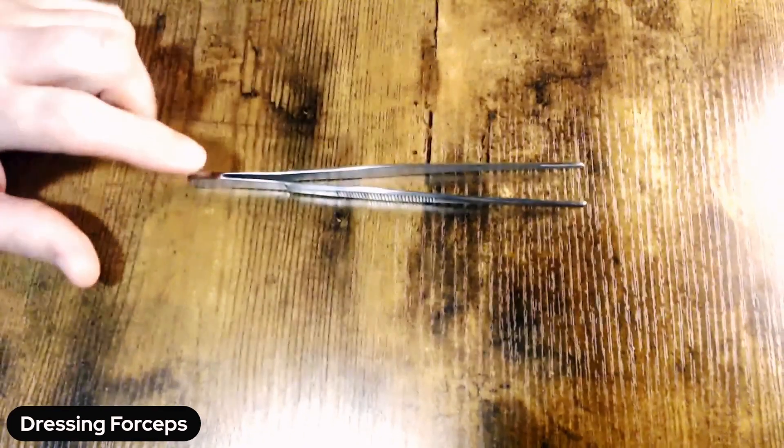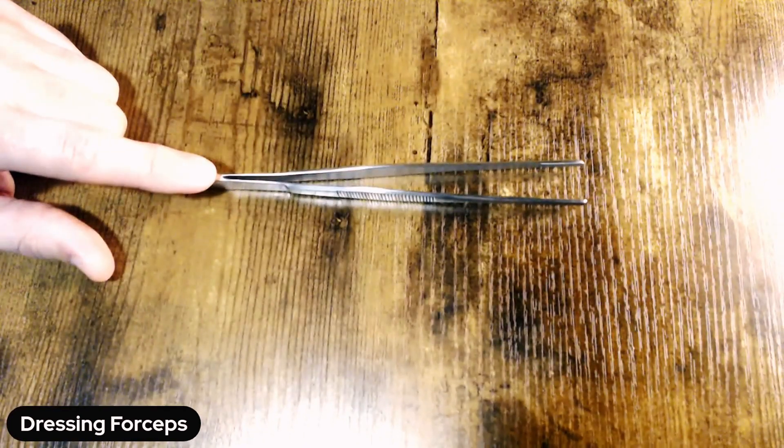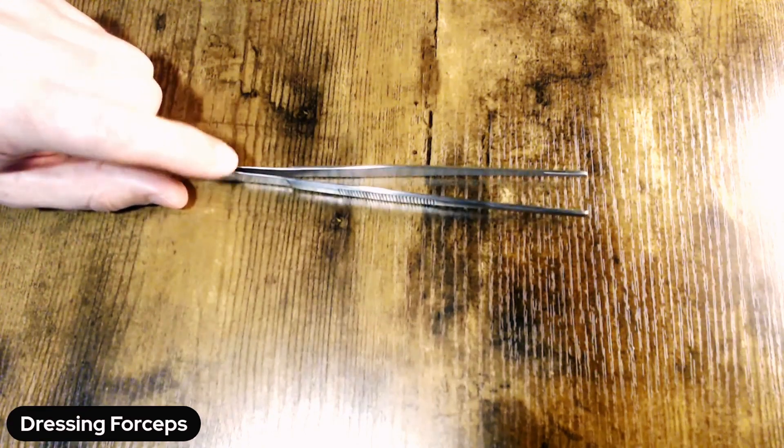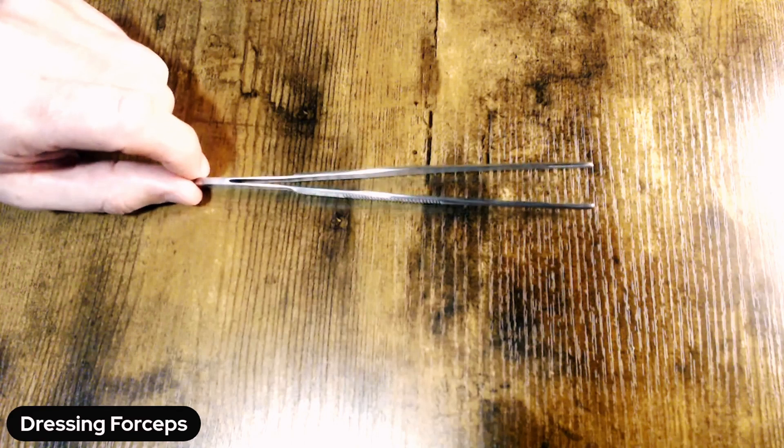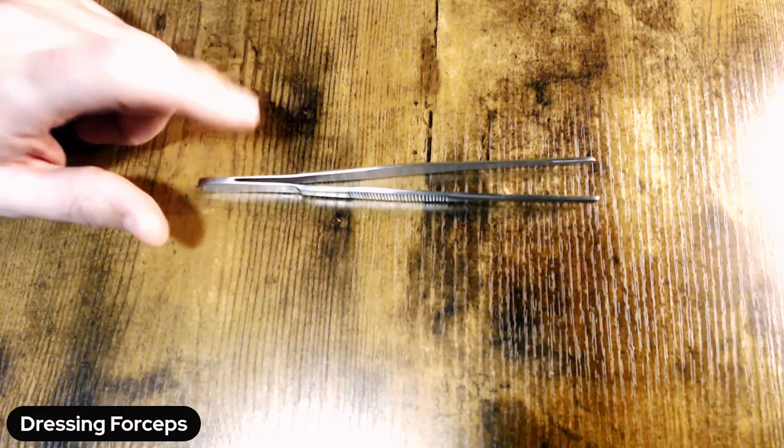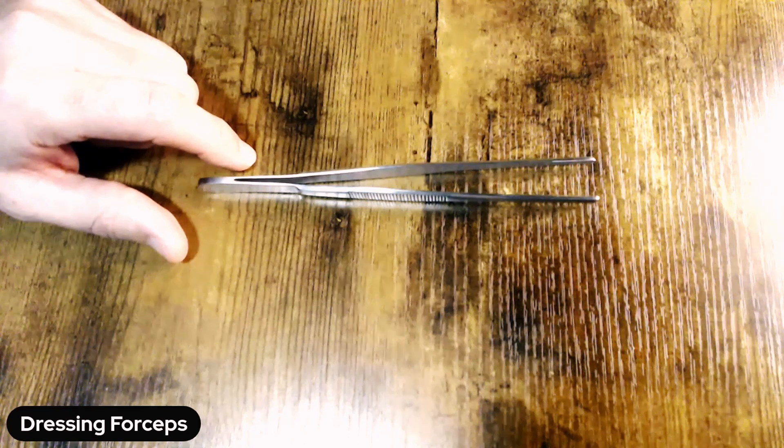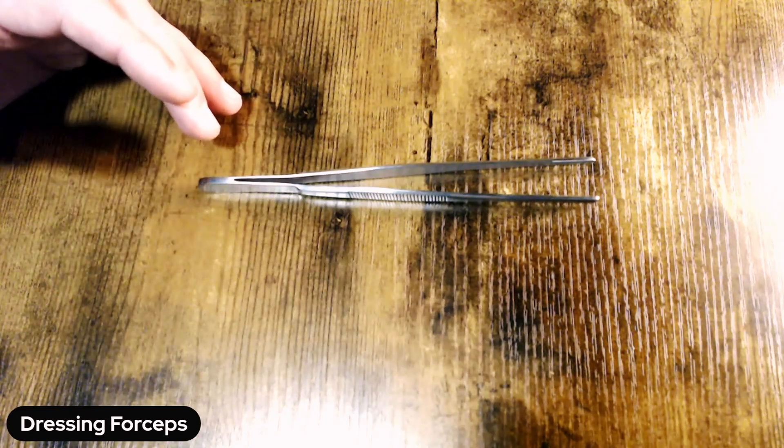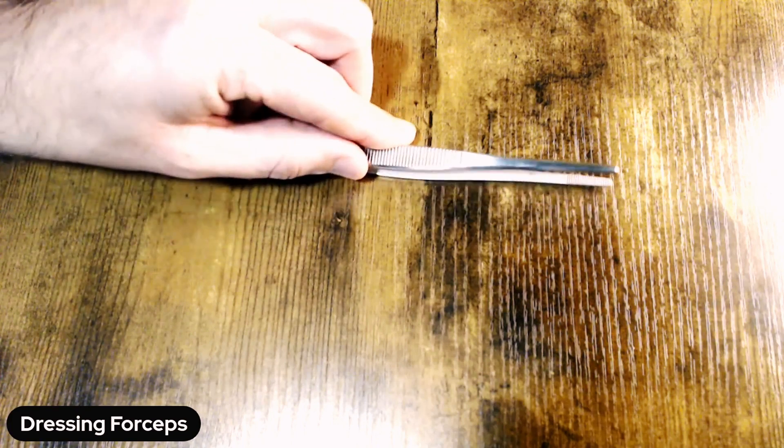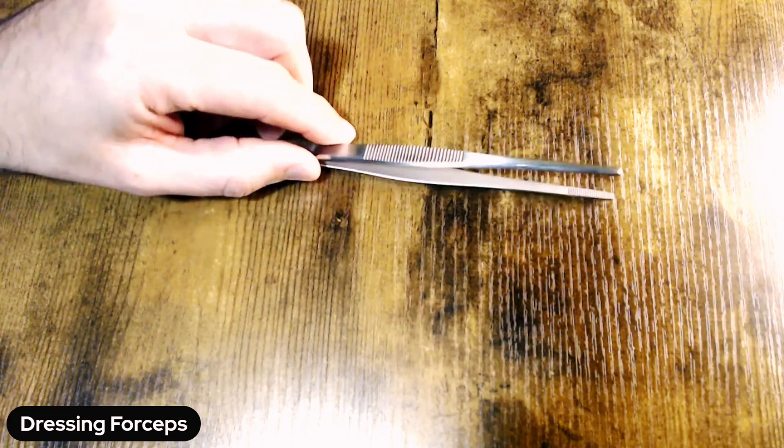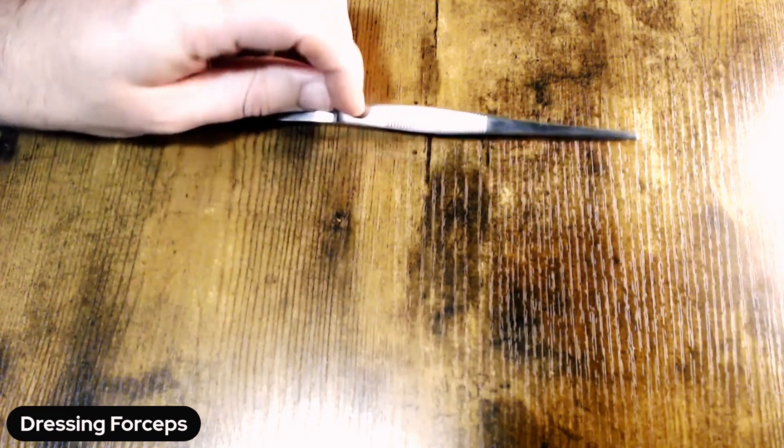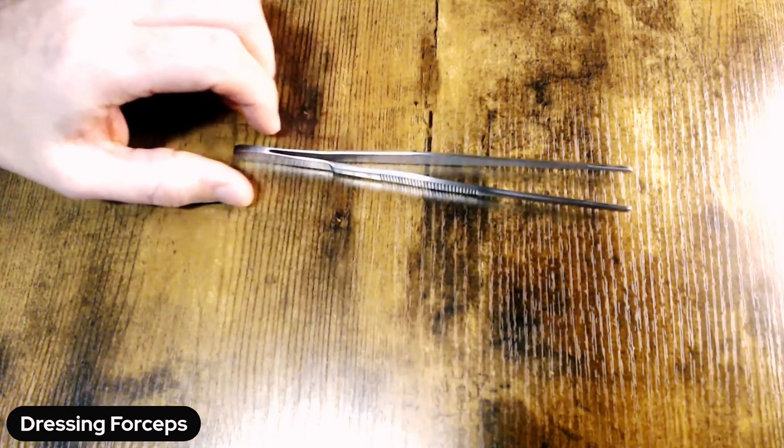And in particular, anything that could be lodged in between these two mated surfaces all the way at the back here. That's an easy place for debris that potentially wasn't even there as a device was used, but somehow got there through that transportation and manual cleaning process. And you're going to want to look at these ridges on the top of the handle here to ensure that they're completely clean and remove any debris.